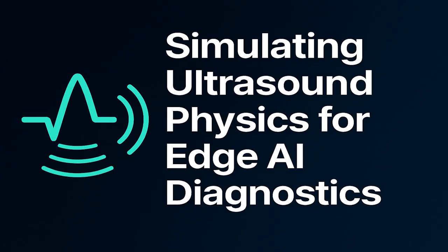How do we quantify that? What's the magnitude of the improvement in the signal-to-noise ratio, the SNR? The quantification is actually very powerful. The desired signal, because it's perfectly coherent, increases linearly with the number of elements. So if you have 32 elements, the signal amplitude increases by 32 times. Okay. But the unwanted electronic noise, that's random and incoherent, so it only increases by the square root of N. So the square root of 32, which is about 5.6. So the signal gets a much bigger boost than the noise.